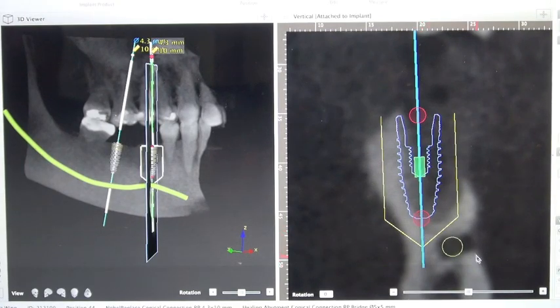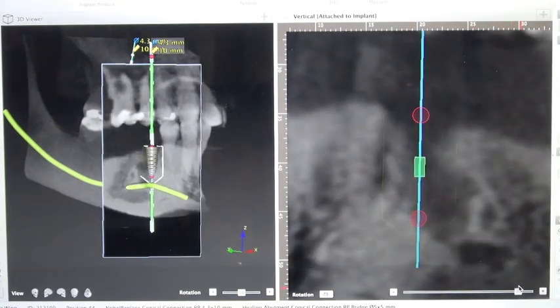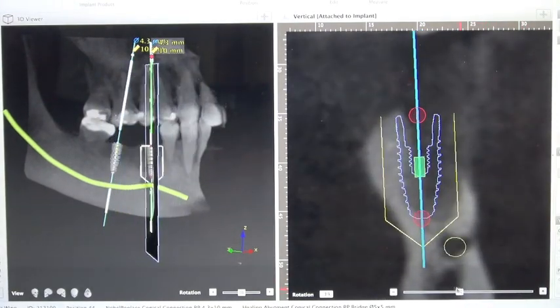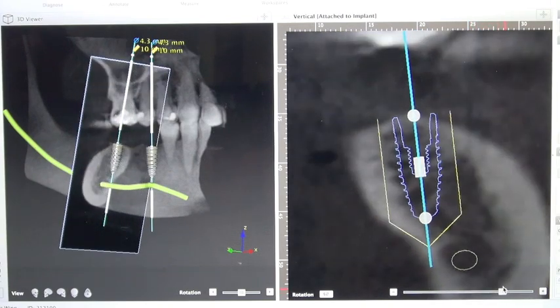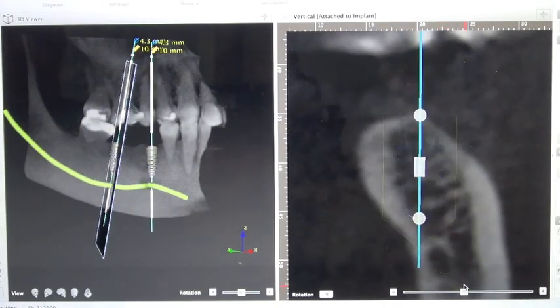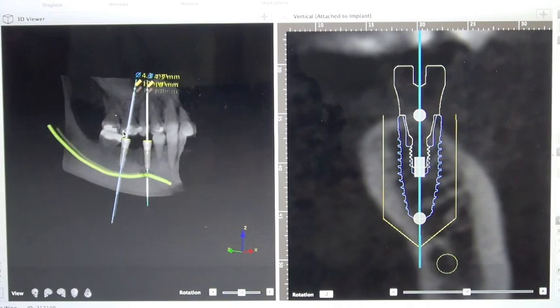It's a very unusual and big nerve. So over the mental foramen we're going to place this implant, and we can see that there was some destruction of the ridge. We're going to open up the ridge and flap it to make sure it's healed quite nicely. Then we're going to take some x-rays to confirm everything is fine before we place the implant. Once we place this implant, we can see there's going to be enough space for the abutment.